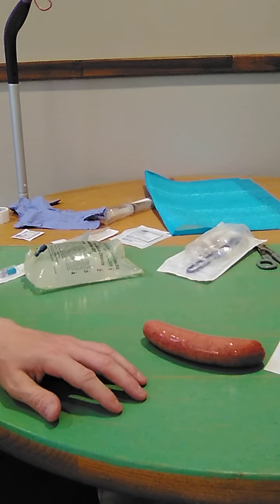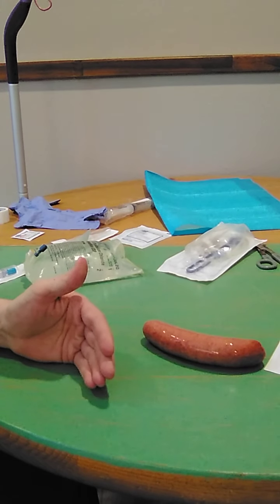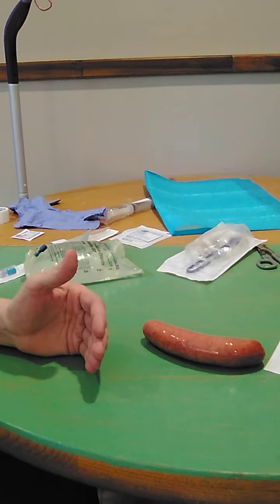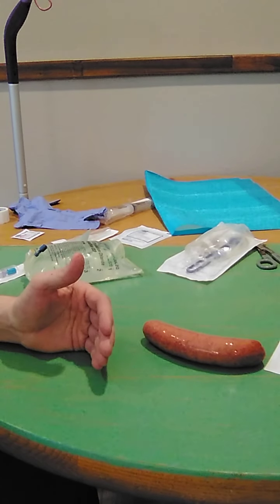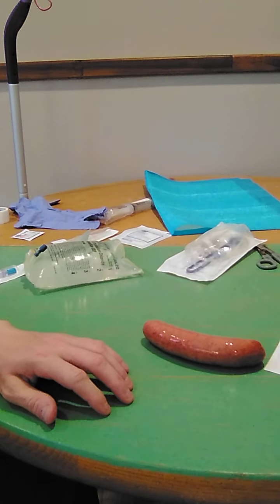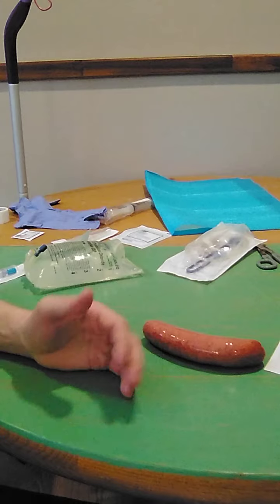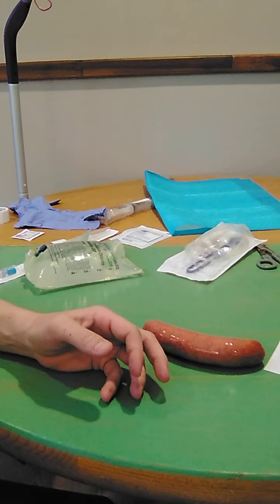He was born January 9th, 1945. I'm going to explain the procedure to this patient, that his healthcare provider has written an order for an IV infusion of 0.9% sodium chloride, 500 milliliters. And so I'm going to put this patient in their bed at a comfortable working height.